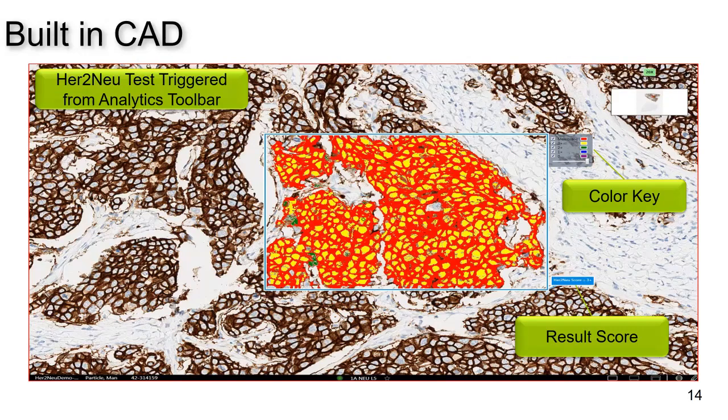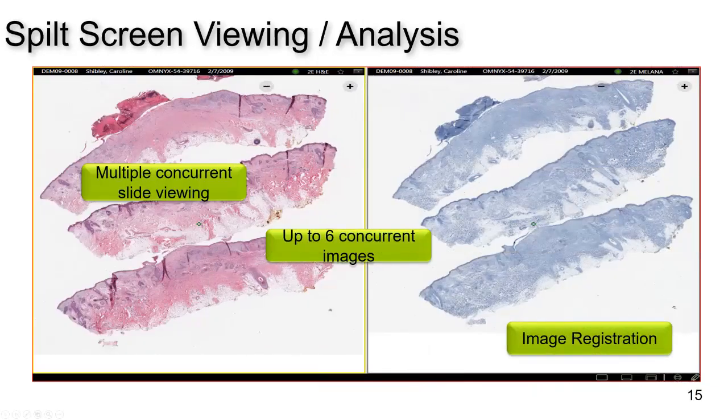We also now can press a button and quantitate the biomarker signal or an immunohistochemical signal. It could be cytoplasmic, it could be nuclear, it could be membranous. But you can see if I attempted to quantitate each cytoplasm or nucleus which was positive, I'm going to be there forever. And I'm going to be forced to give an inaccurate, subjective answer. So we can now use AI to quantitate things more easily.